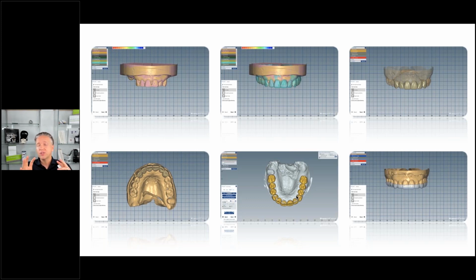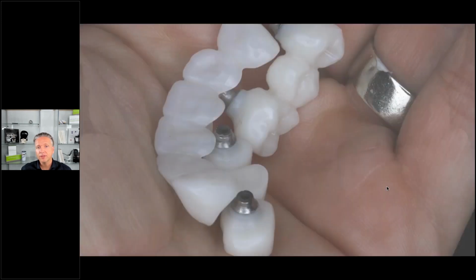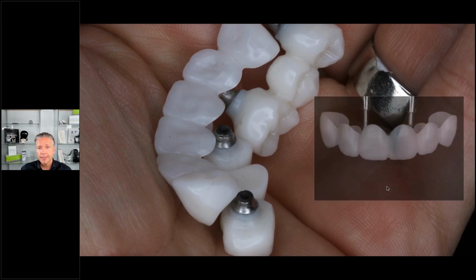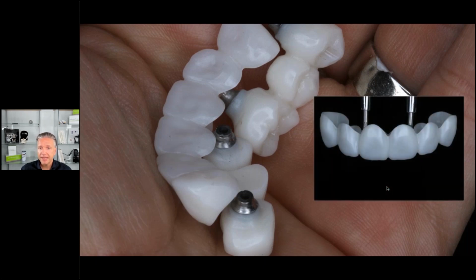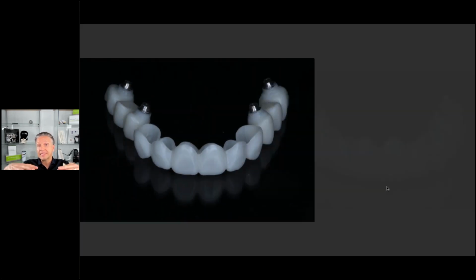Also, to seat everything together with full control over position, vertical and aesthetics, we created a little seating guide, which you see here over that new design. Here you see it larger. The design was saved as an STL. We designed the seating guide, the seating jig, and printed it. Here is the quick print of the teeth. Here we milled the shells. We milled the PMMA implant bridges, bonded to titanium bases, and here the multi shells in a different view. Here everything together, and here you see how everything fits nicely in that seating guide.